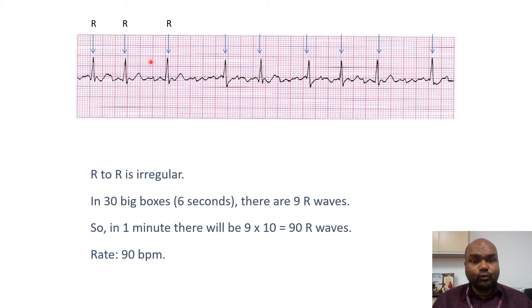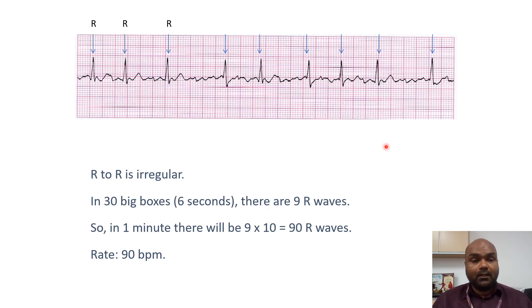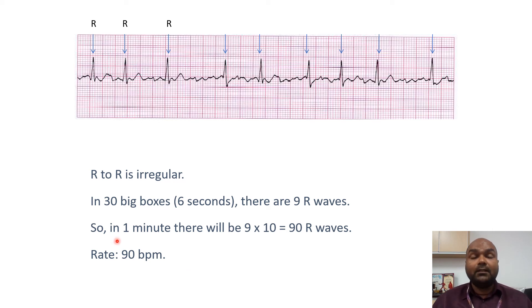Counting the R waves: 1, 2, 3, 4, 5, 6, 7, 8, 9 — there are 9 R waves in 6 seconds. Since 6 times 10 equals one minute, you multiply the number of R waves by 10: 9 times 10 equals 90 R waves in one minute. So the rate is 90 beats per minute. It's that simple to calculate the heart rate for an irregularly irregular rhythm.